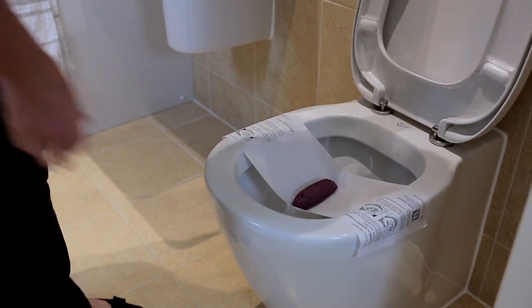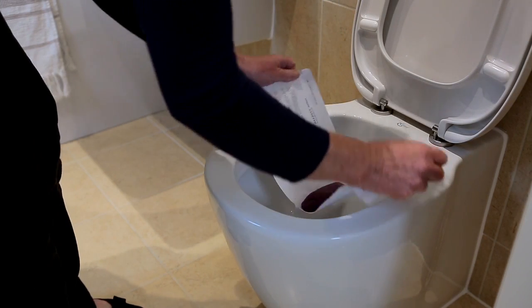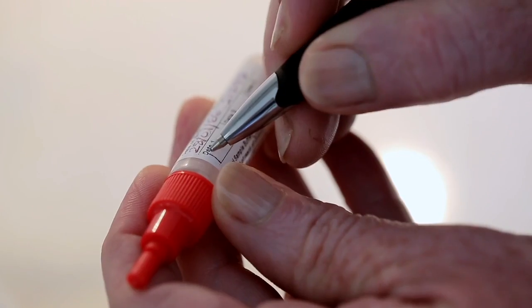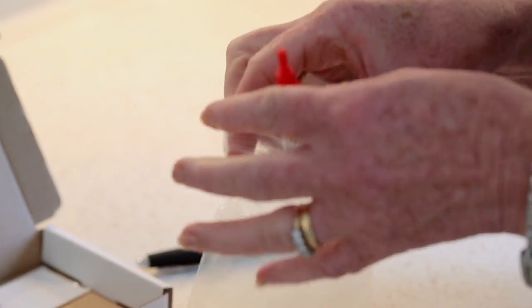Now you can lift the toilet seat to release the stool catcher and flush it away. Wash your hands again and you're finished. Making sure the lid of the tube is secure, write the date on the tube and place it into the small plastic bag. Store this in the refrigerator and repeat this process over three consecutive days if you are able to.